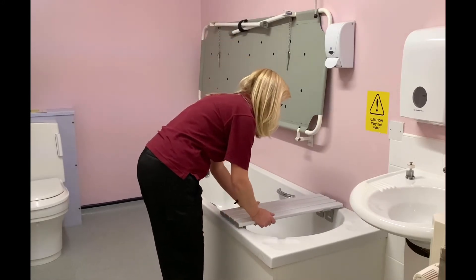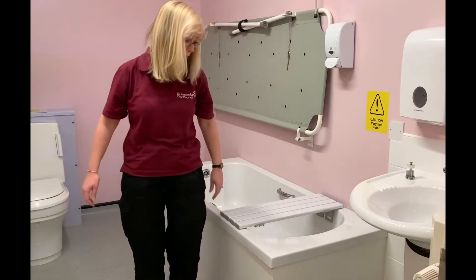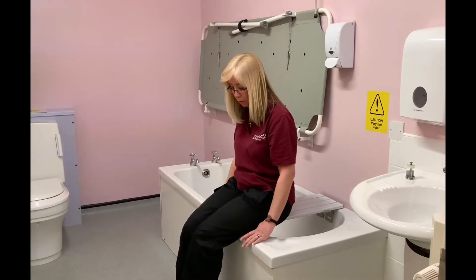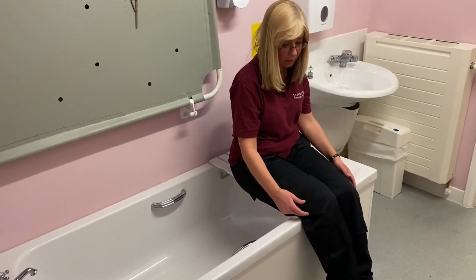Once the bath board has been adjusted and you have a secure fixing, you would transfer into the bath by sitting onto the bath board and pushing yourself backwards until you can feel the bath at the back of your knees.